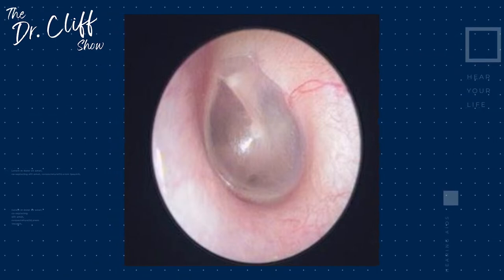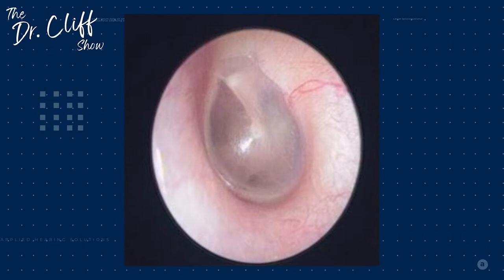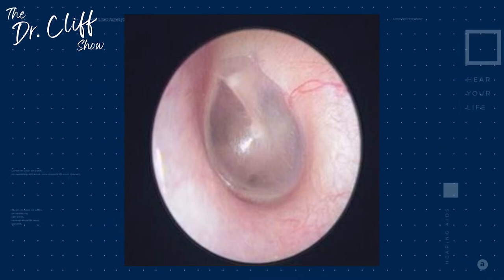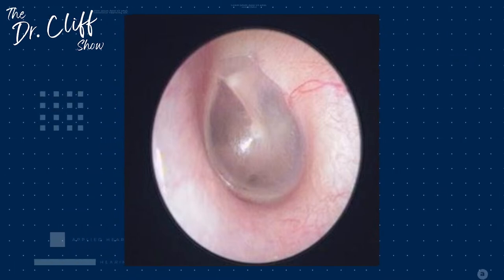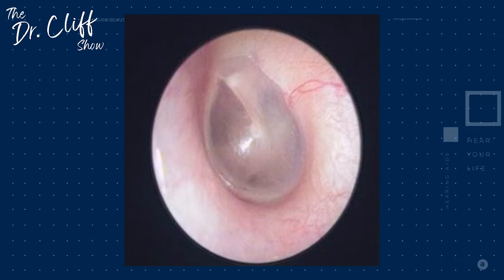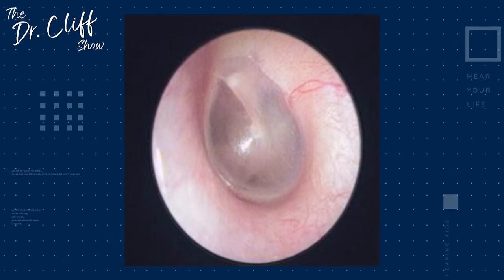And when we look at the eardrum, what we want to see is a certain level of clearness? Yeah, like translucent. Translucence, yeah. Thank you. And also we see a little bit of a flashback. You can see on that bottom left-hand side of the eardrum a little bit. We see the light reflecting there. Generally, that's really indicative of a healthy tympanic membrane. We also see going from top down to the middle there, that's actually one of the middle ear bones that's behind the eardrum and attaches to the eardrum. But overall, when you look around, things look healthy, they look clean, no glaring issues or concerns there. Very normal, very healthy ear canal and eardrum.